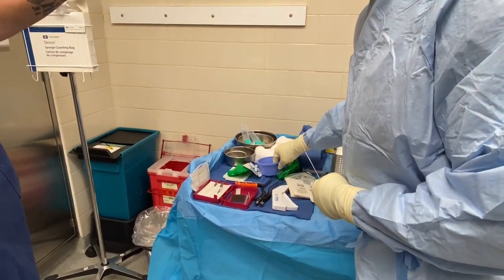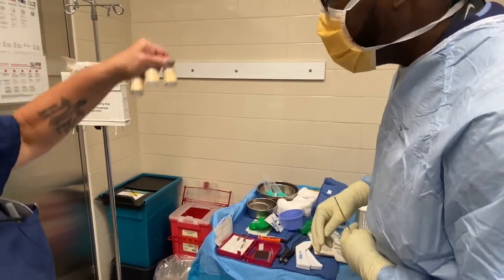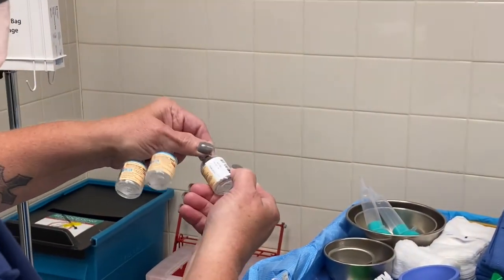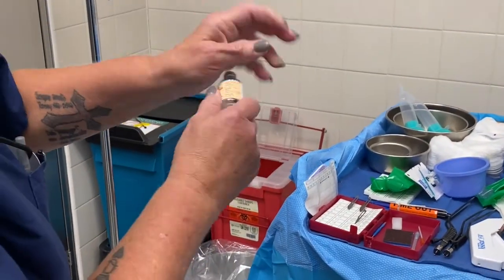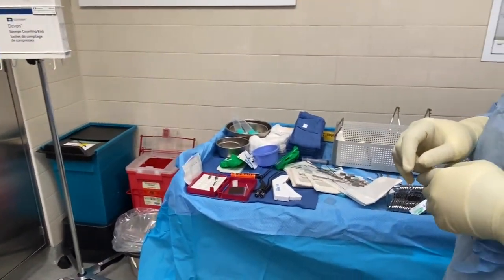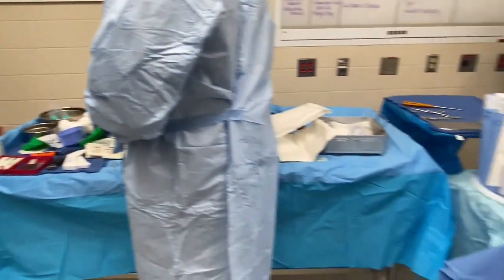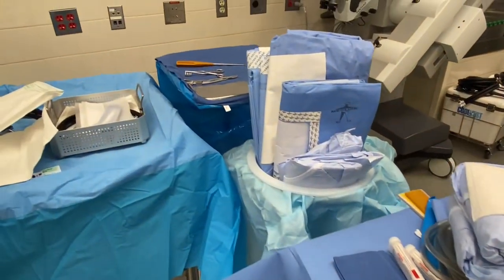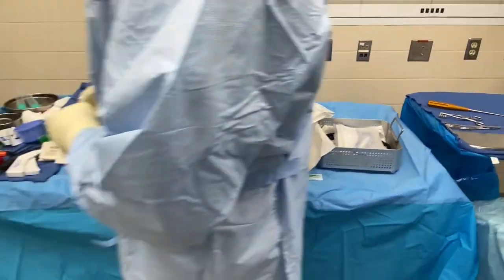Marcaine with 1 to 200,000 epinephrine — right here. I have thrombin and Surgiflo but we'll wait on those. Make sure you have labels. All right, let's go ahead and count.